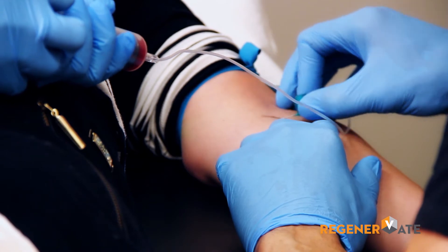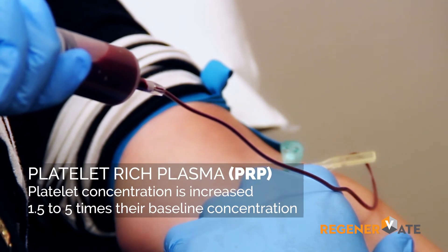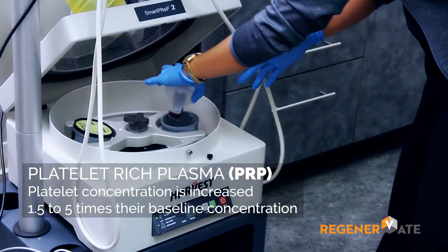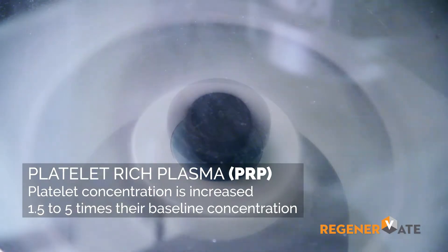The first step in this process is drawing blood from the patient in order to make platelet-rich plasma. This is done by placing the blood in a container and then the container is placed in a centrifuge. It's spun down for a number of minutes, and this varies depending on the system.